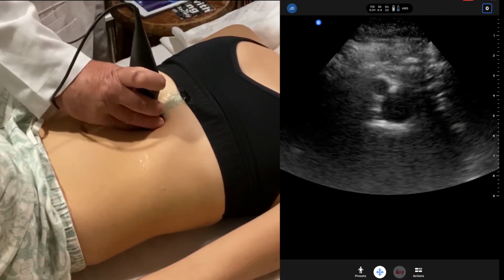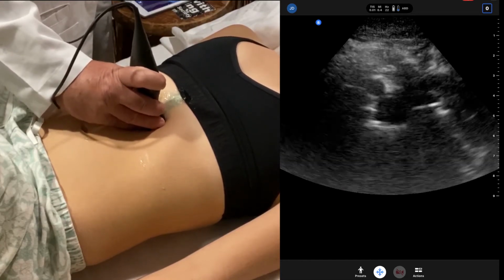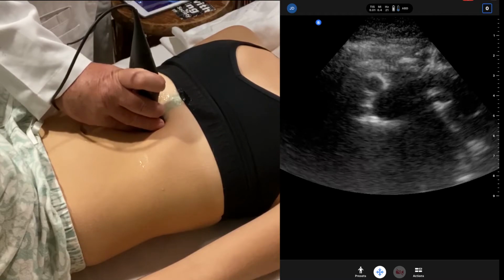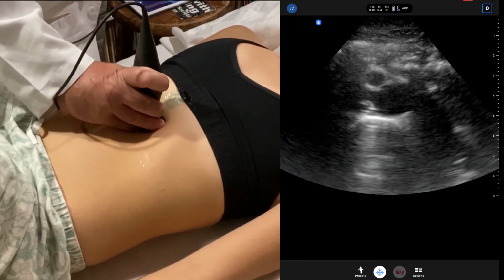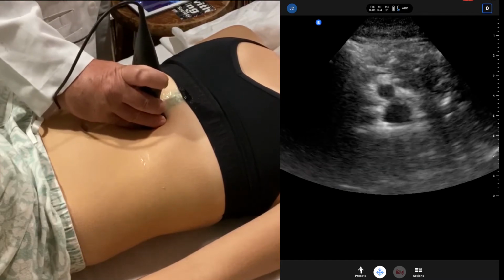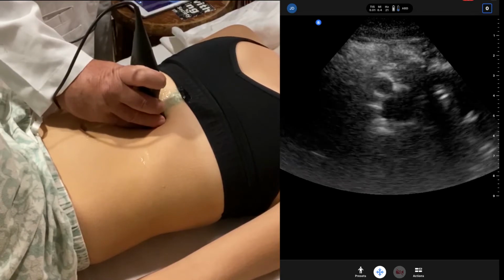So as we scan down further, we'll keep the aorta between the liver and the spine shadow. We are looking for the superior mesenteric artery, the SMA. Above the aorta here is the SMA. So we can see a nice picture of our SMA right there, the superior mesenteric artery.